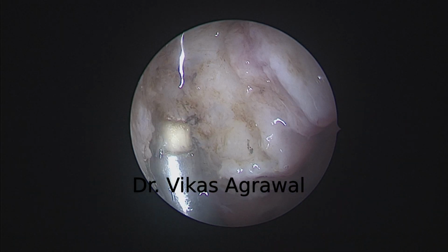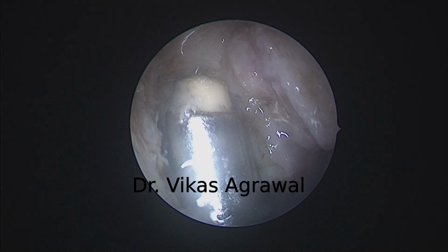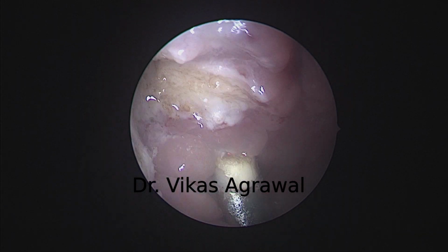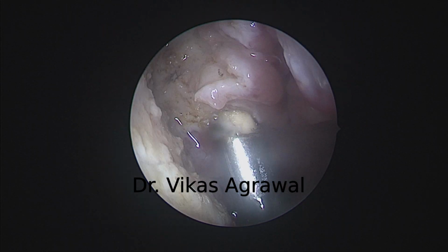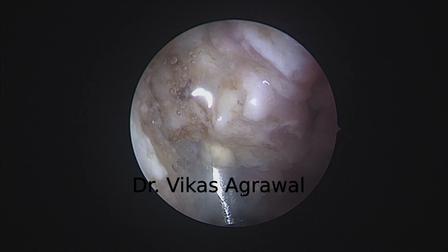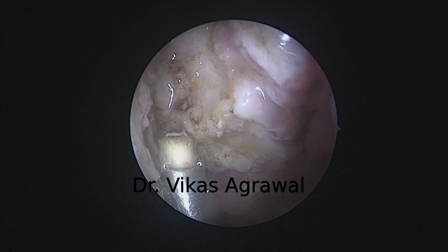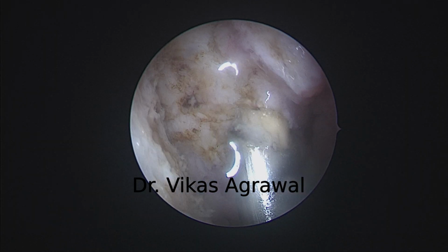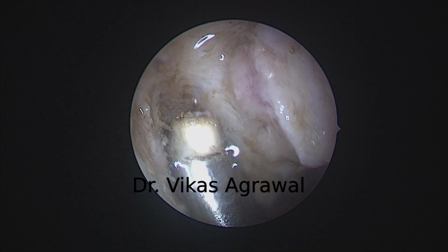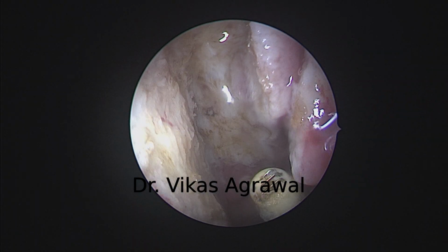Those who are interested can go through it. Now, this is the Passavant's ridge area. Still, there is a lot of adenoid tissue. That's the fossa of Rosenmuller, which is completely cleared.